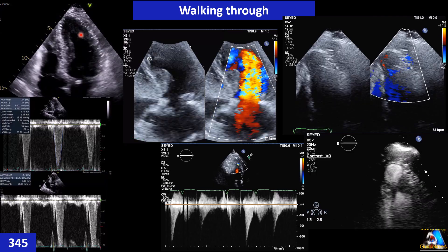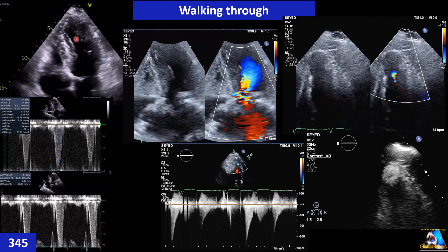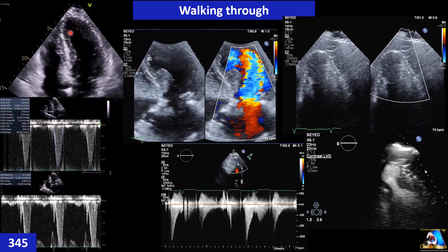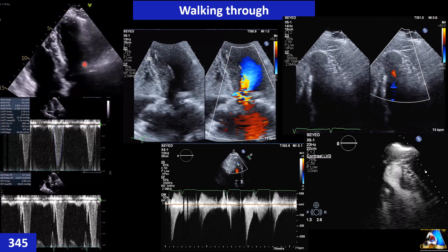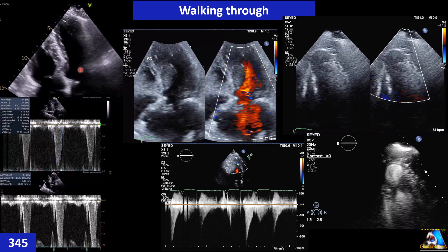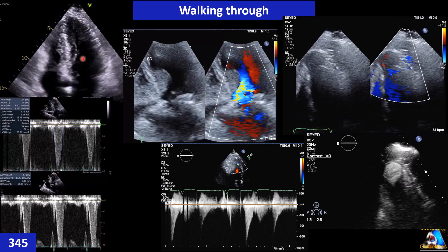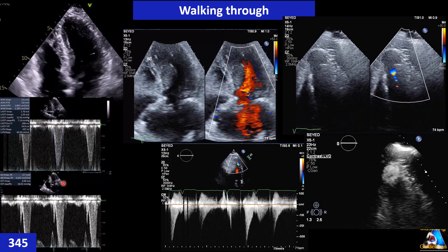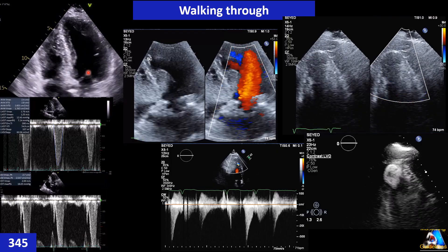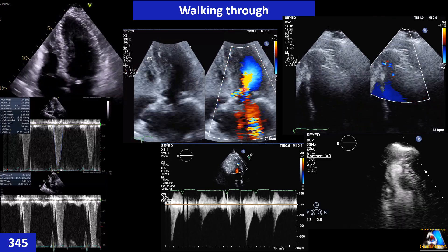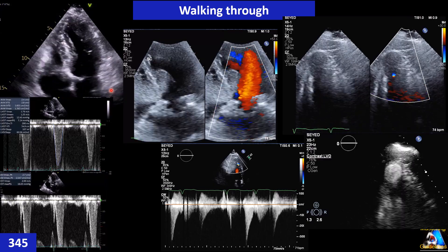To confirm, we do pulsed-wave Doppler and 'walk through' the LV — especially with concentric hypertrophy — from apex to LVOT. We place the sample volume at different levels: first at the apex, then a little lower, then mid-cavity, then basal, and finally at the LVOT — four to five steps — to find where the highest velocity is. Here at this level we have higher velocity close to 2 m/s.